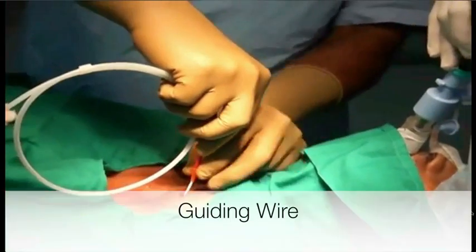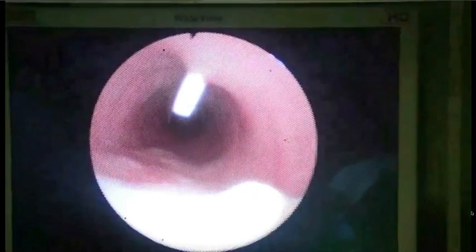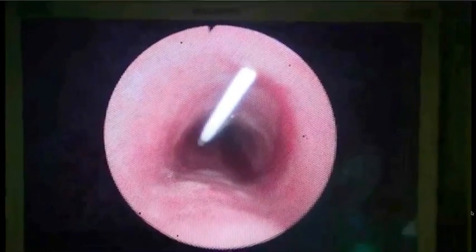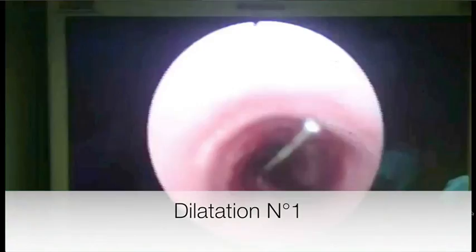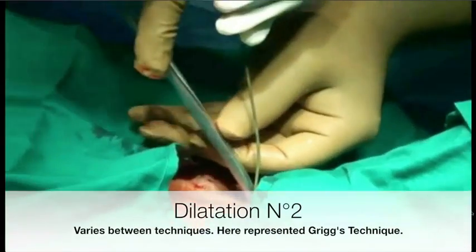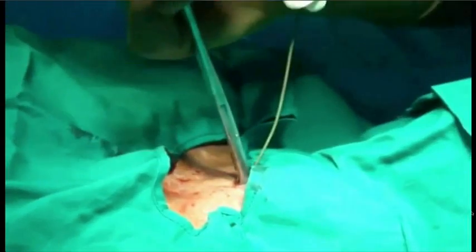The second step is the insertion of a guiding wire, which leads to the introduction of other elements such as dilatators. Fibroscopic vision remains essential throughout. A first dilatation is made with a short dilatator to open the trachea for the first time. Then a second dilatation is performed — this varies between techniques. Here the Griggs technique is demonstrated, using a forceps for the second dilatation.